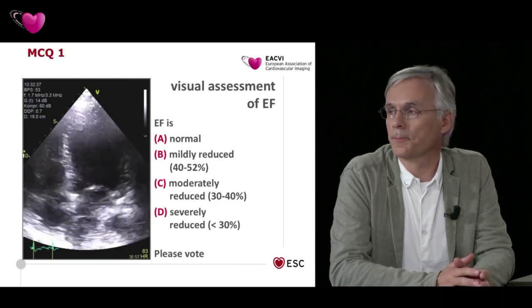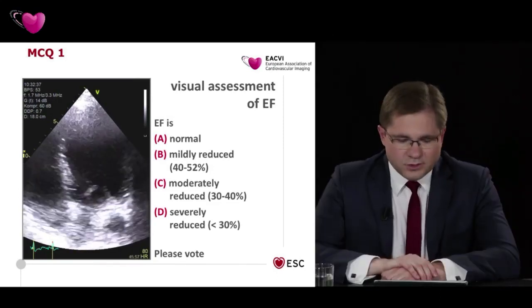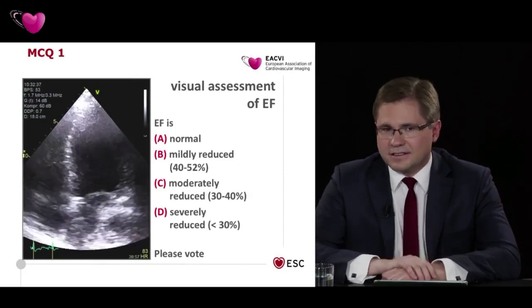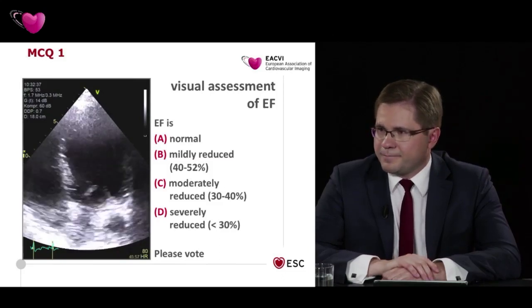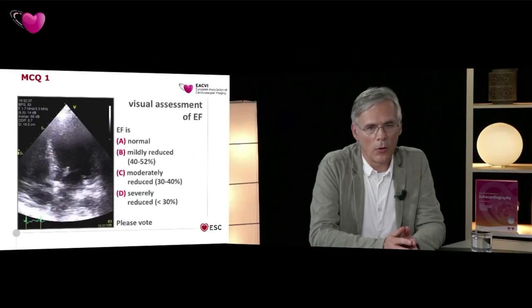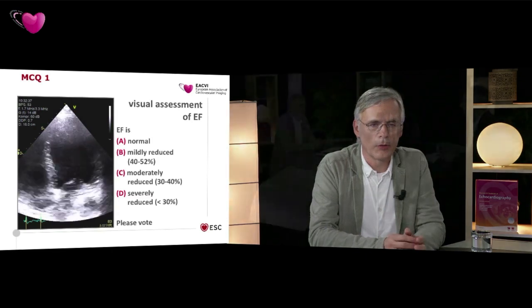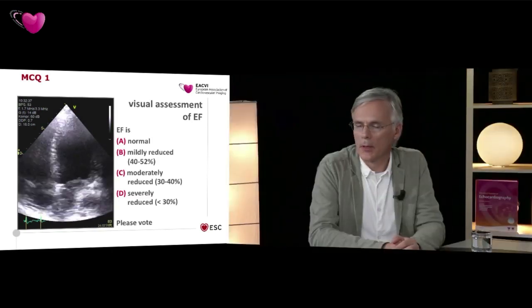Please vote. Okay, so now we are waiting for the results to come in, and while we have a few seconds, is this an example of a patient in whom you would consider contrast echocardiography? Yes, we always consider in these patients contrast, especially in those patients where image quality is reduced, as in this patient.